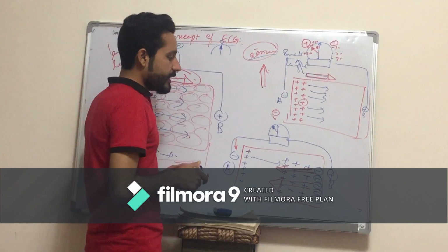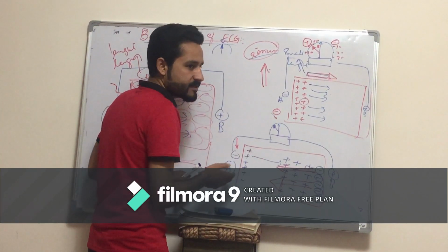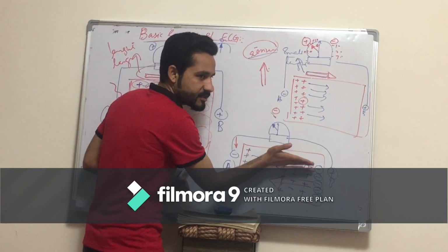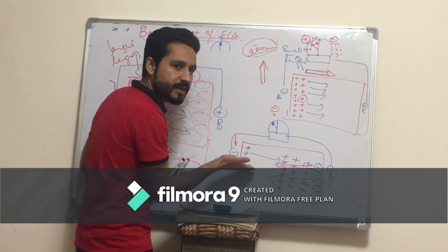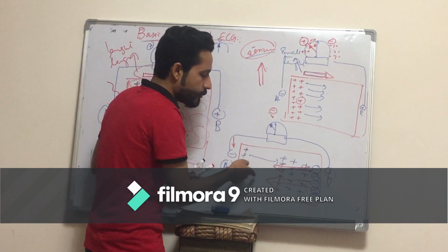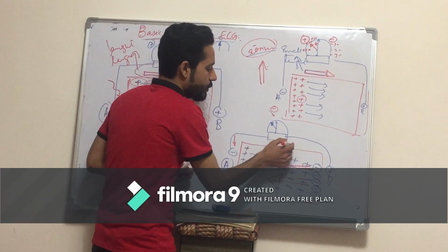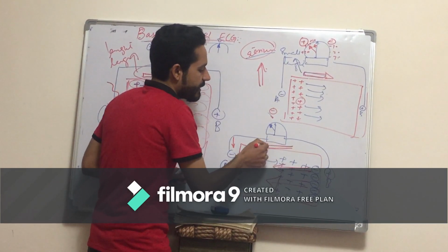And as you know, repolarization starts in the inverse direction to the depolarization. The depolarization is in this direction, so obviously the repolarization will be opposite to it. So this is repolarization. The direction of the repolarization is opposite to that of depolarization. So the vector will be in this direction.